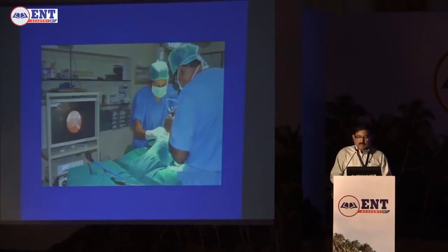The company claims 200 scopies for every salivary endoscope, but in India, if you are going to do 200 scopies and then throw away scopes, we'll have to charge too much for our patients, and we have to be careful in handling and prevent damage.